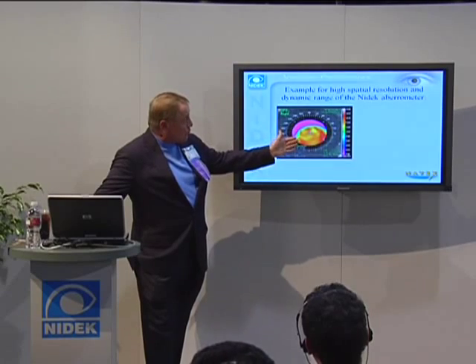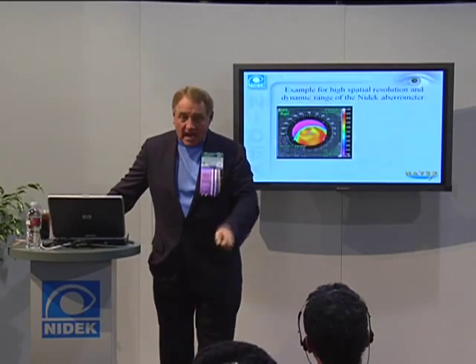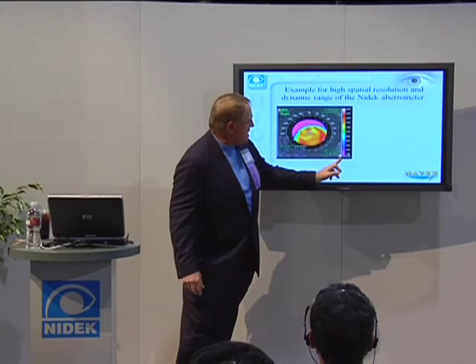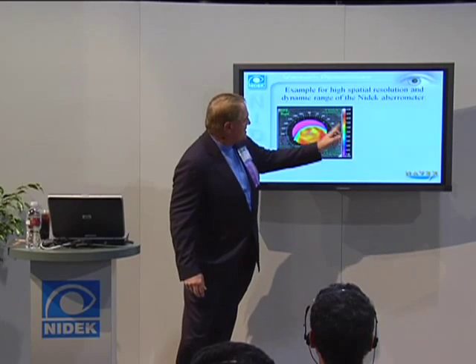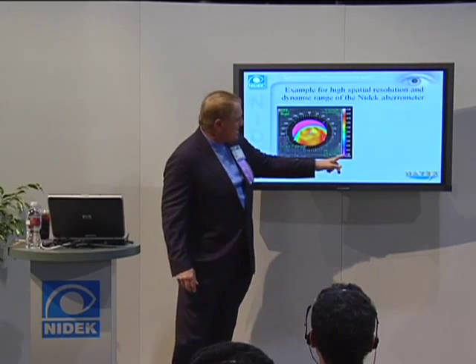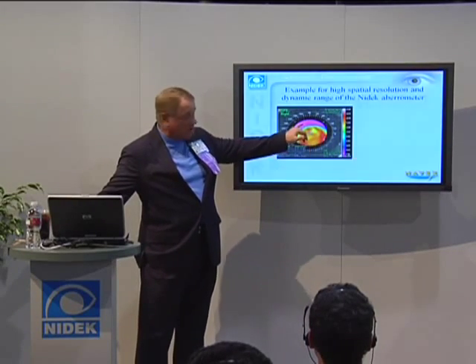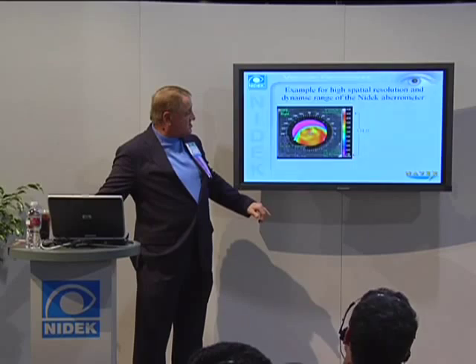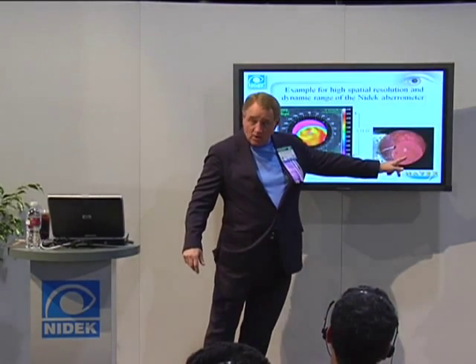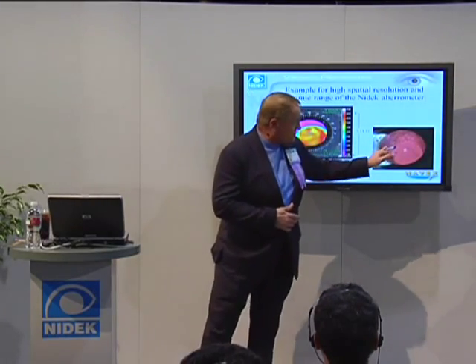We can look at that, and that wavefront, unlike others, can be directly in diopters. So when I look at this scale here, what I see is in diopters, I see something here that changes in power. So when I get up to the red, I'm about -5. When I'm down here, I'm in the plus range. Basically, it's telling me what the refractive error is here and here. And when we look at that patient, what we see is it's an IOL. And we can tell the power here, and we can tell the power there is that aphakic refraction. Now look, this capsule's opacified.